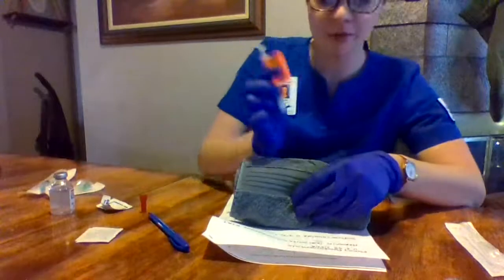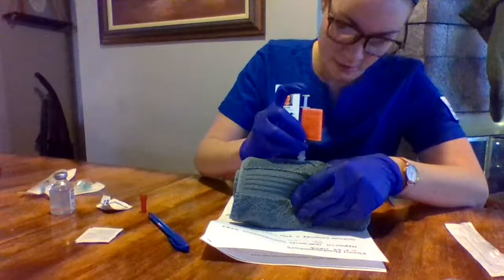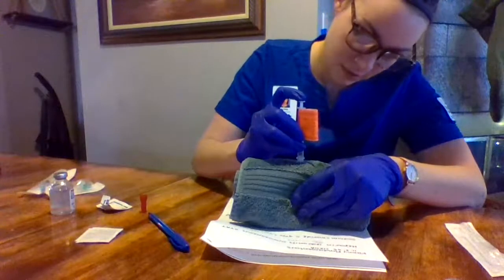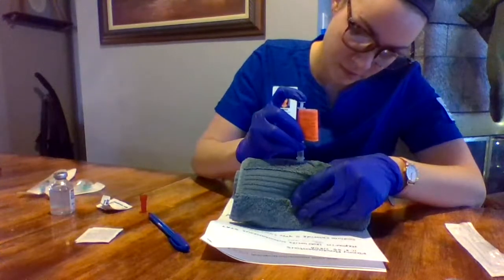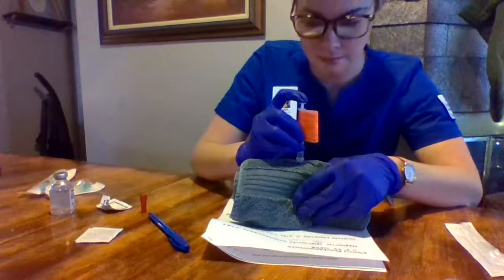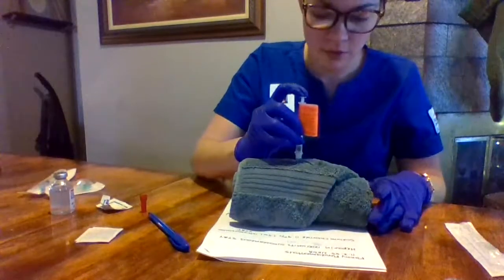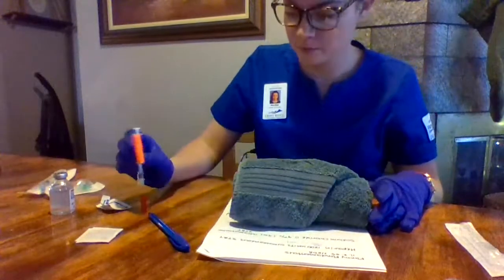Alright, Fanny, you're going to feel a little poke. 90 degrees. Insert my medication slowly. Wait for 5 seconds. Unbunch the skin. Remove the needle.